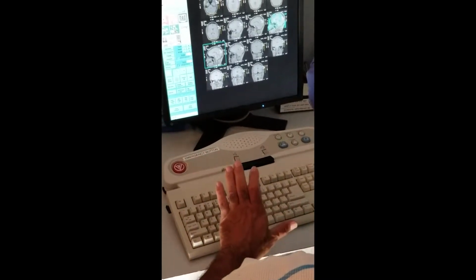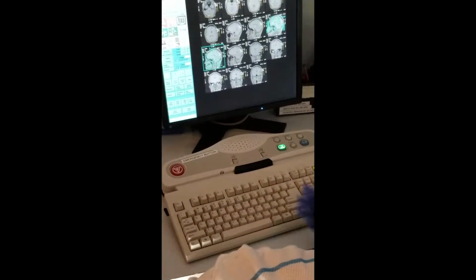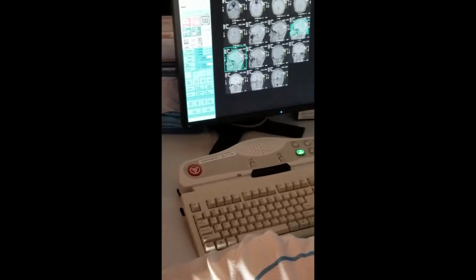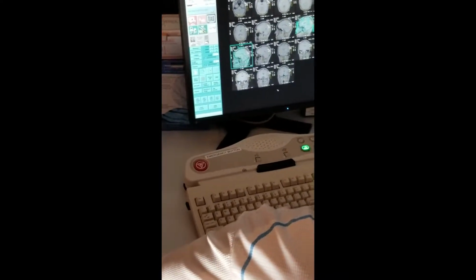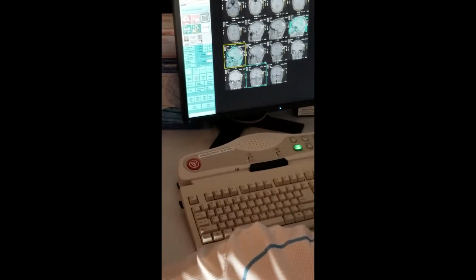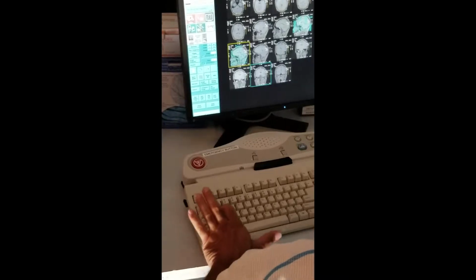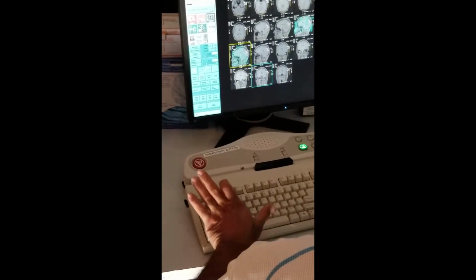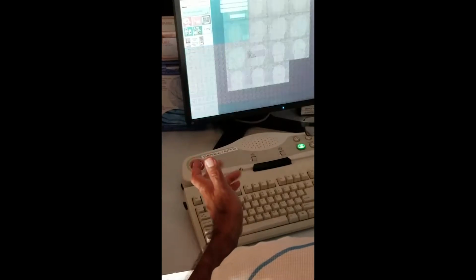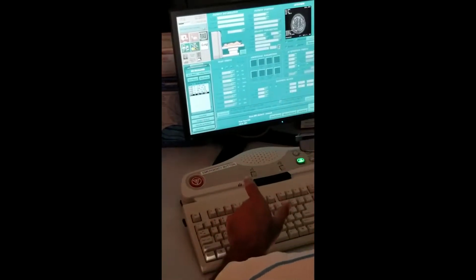I saw his fingers. What did I use to prescribe my sagittal? Coronal. Any coronal. What do I type? XR. Space. 2. I forgot. Cheat. Sagittal. Oh, it was 2.